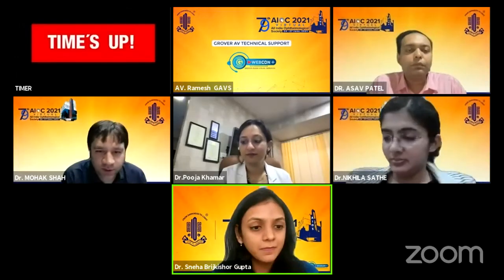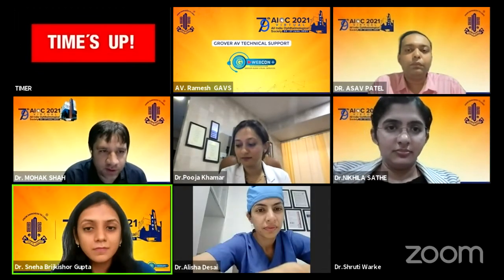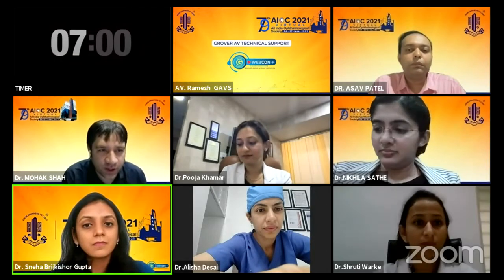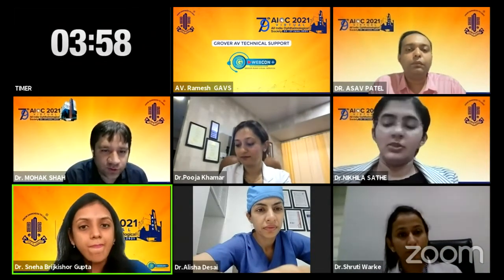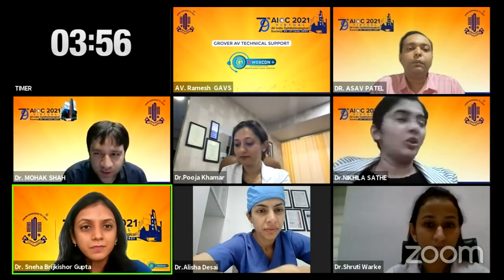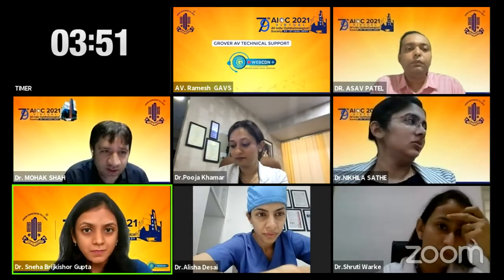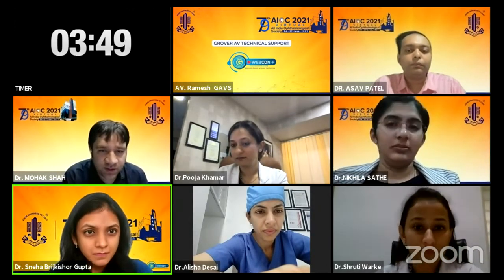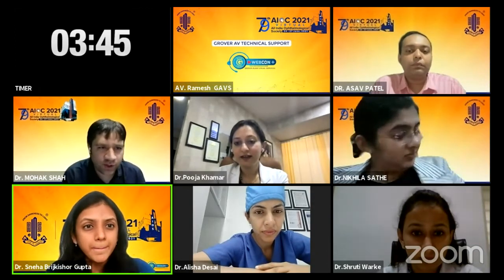Excellent presentation, Dr. Sneha. Thank you, sir. I think I have seen many of these types of scars when there is some complication with the blade LASIK surgery gone wrong. There is a buttonhole, as you rightly mentioned, especially in the steep cornea, or if we are reusing the blades. So the take-home message is do not reuse the blades. And for this scar management, the software you showed is only available for the Schwind. Is there any way, if we don't have the Schwind machine, that we can do it on any other machine like this? Any idea? Or what would be the mode of treating?